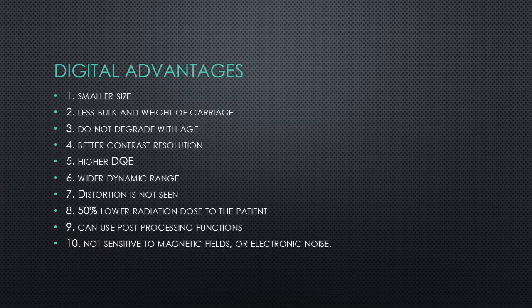The spot images are operated at regular static imaging mA of 100 to 1200. The dynamic and static images can be archived into PACS, but they do have large file sizes. Static spot images can be about 8 megabytes apiece, and dynamic images can be as large as 240 megabytes per second. There are many other advantages, and they're listed on this slide.